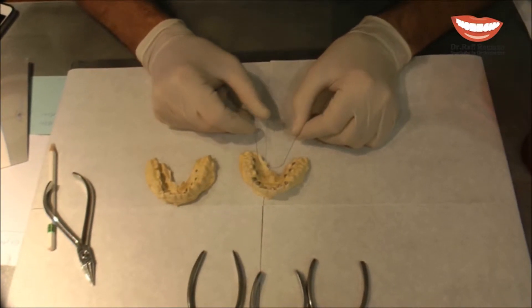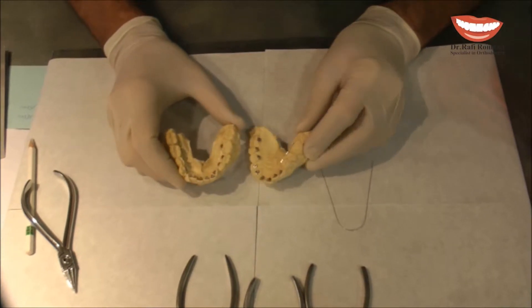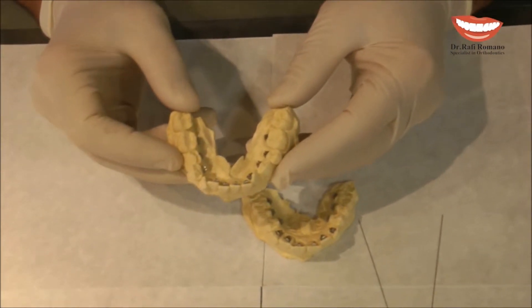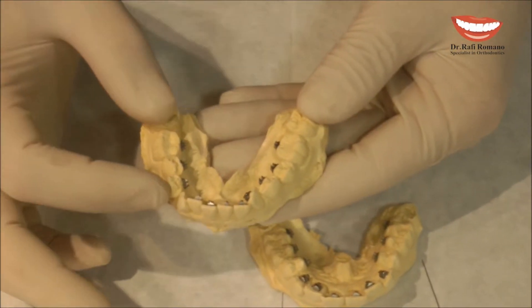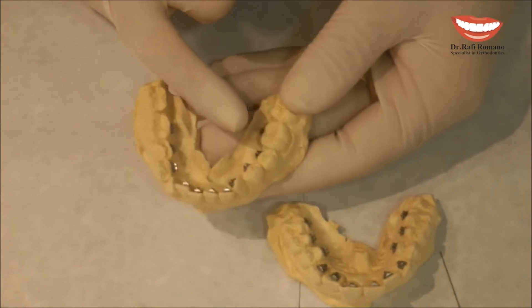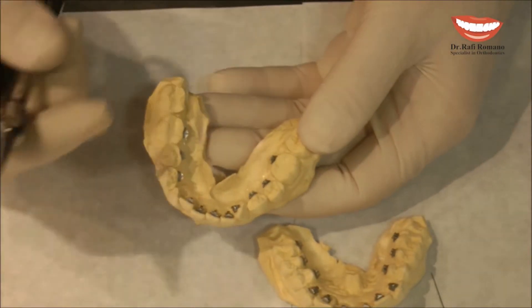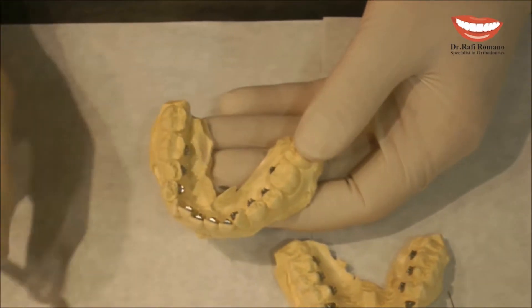The second band is a proclination band. It's a matter of treatment decision when we want to do proclination, where the proclination is going to occur. If the posterior part looks quite nice and we want to procline the teeth from cuspid to cuspid, then I will create my stop between the cuspid and the premolar. How do we do it?